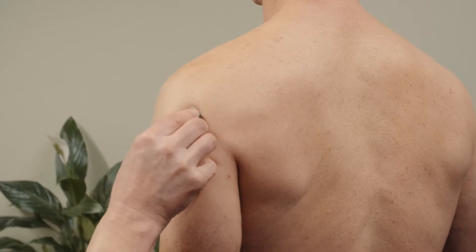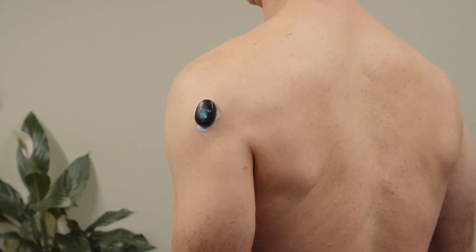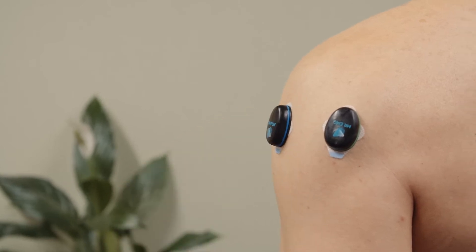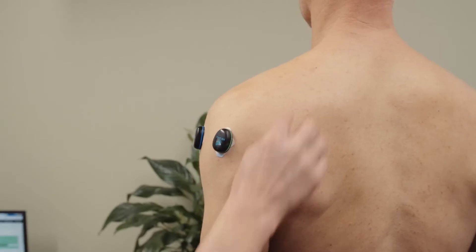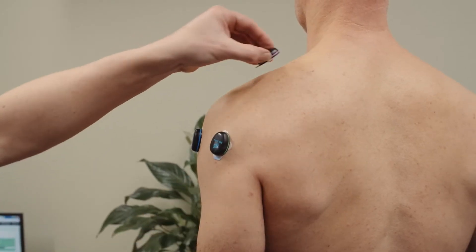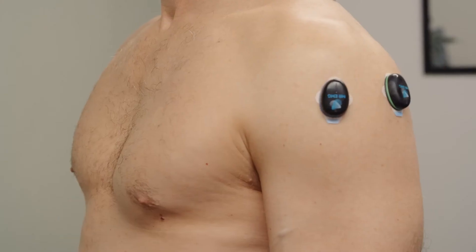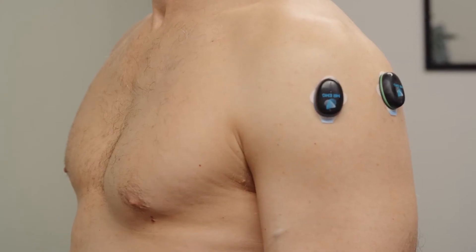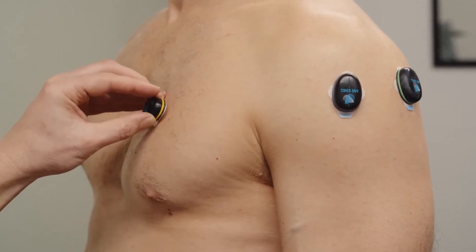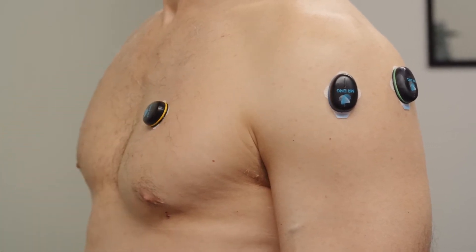This video shows the assessment of four shoulder muscles and their possible relationship to shoulder pain using Mr EMG. The four muscles you choose when assessing the shoulder is entirely up to you, the clinician. In this video we will test the rear deltoid, lateral deltoid, upper trapezius, and pectoralis major muscles.